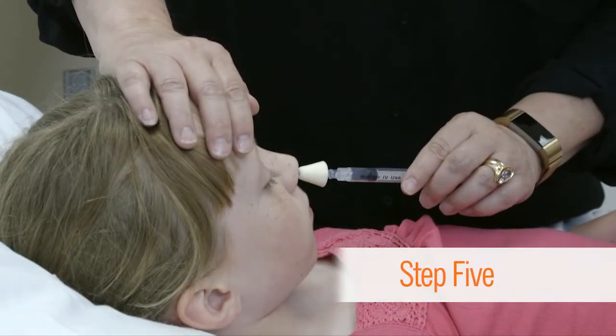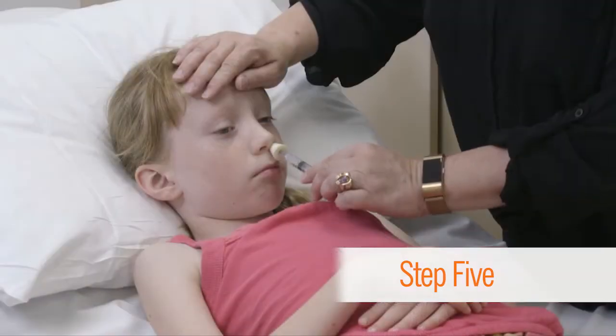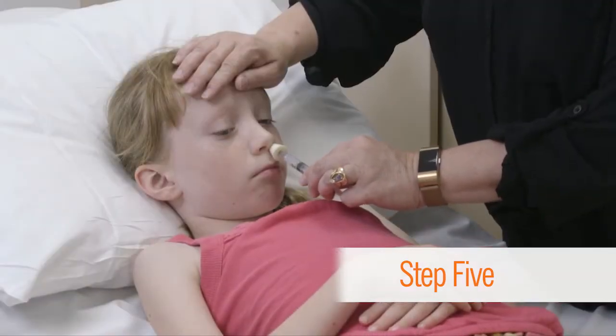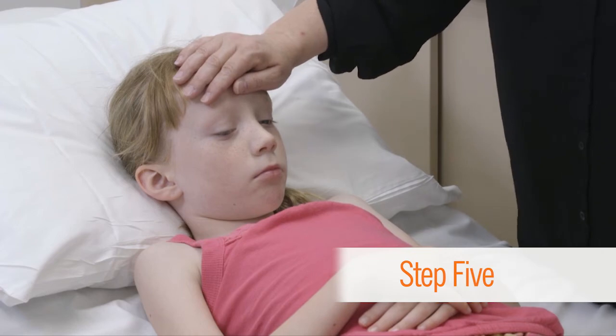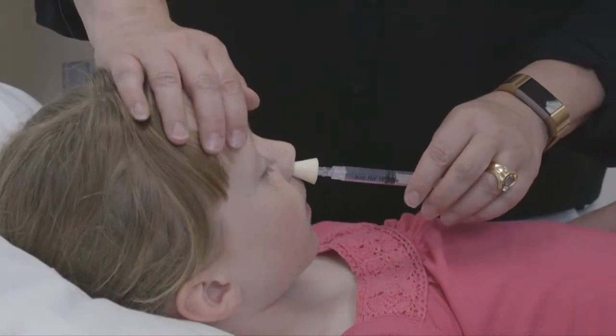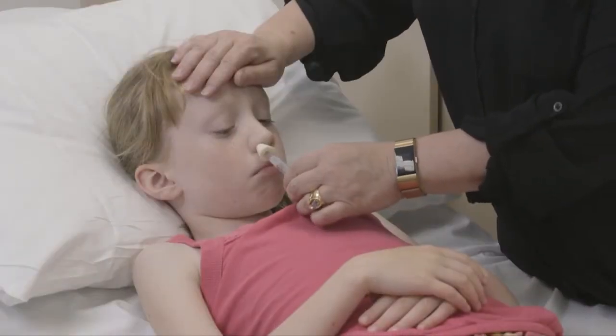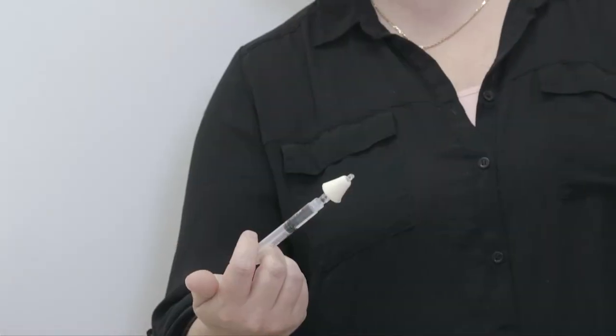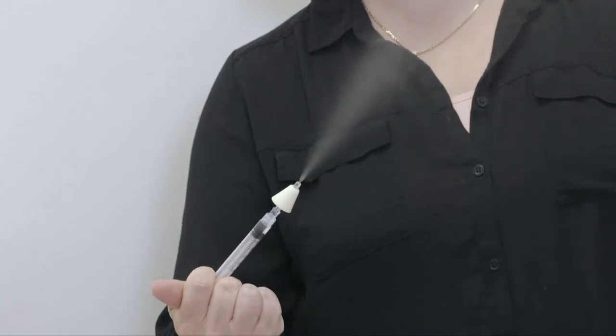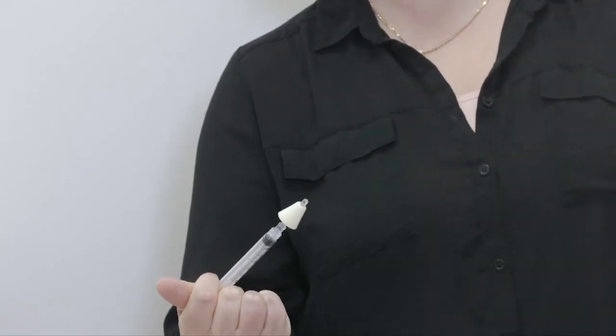Insert the atomizer into the nostril and deliver half of the medication through one side. Then insert the atomizer into the other side and deliver the rest of the medication. When the medication is administered in the nose, it will come out as a spray or mist.